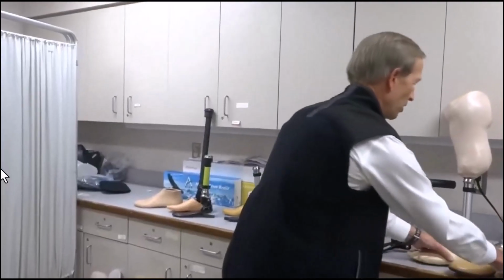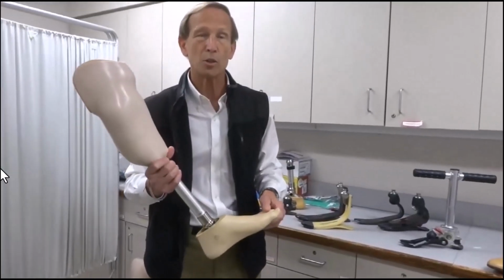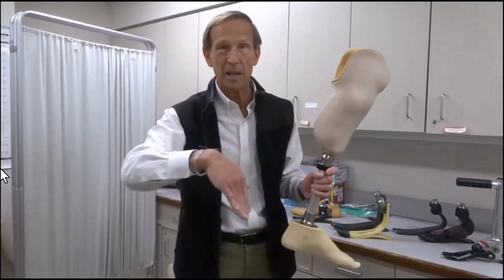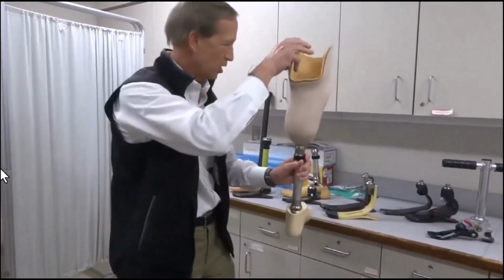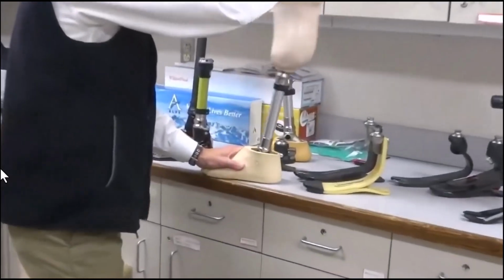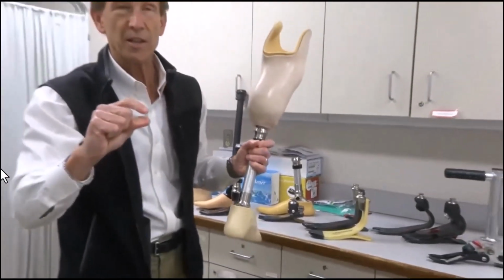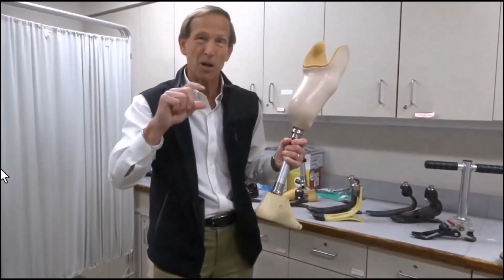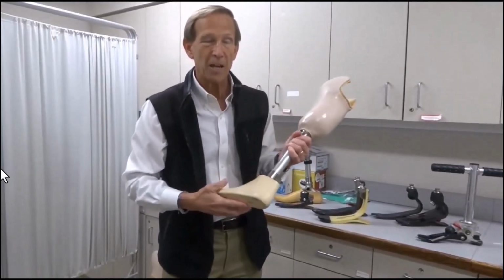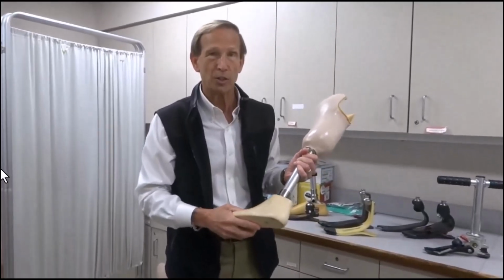For most of our patients that are going to be walking indoors, you're also allowed to go to what's called a single axis foot, a foot that pivots up and down in one direction. So if I put this foot on the floor, you can see how it tilts up and down. There are rubber bumpers in there that will determine how much it bends or how soft it is, but it's still very lightweight, very simple, and qualifies for a patient that's a level 1 that's going to walk indoors on a relatively flat surface.